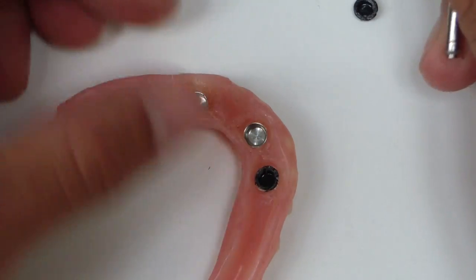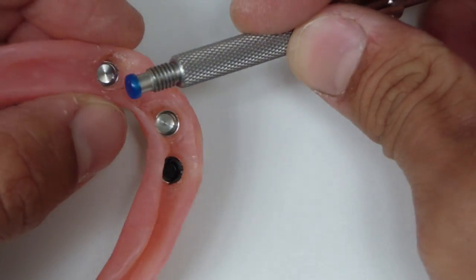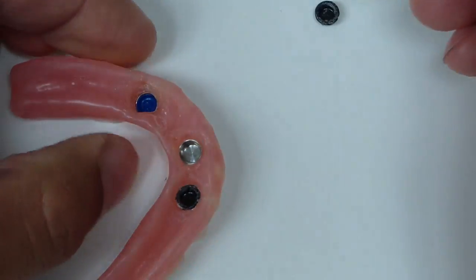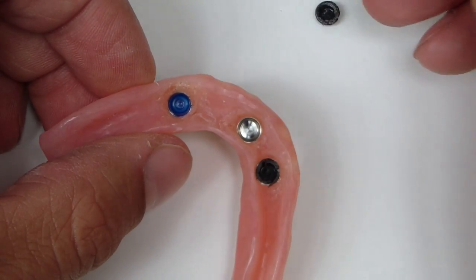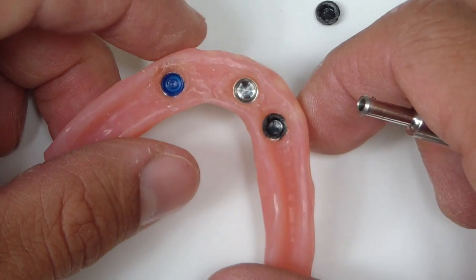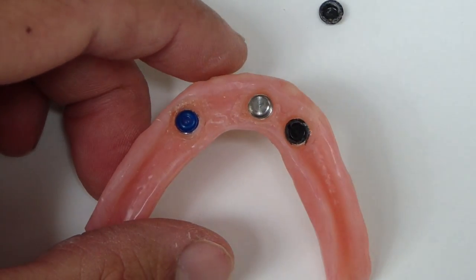We're going to start with the blue nylon insert — you can see it here — and we'll just place that into the denture now. Just like that. We typically start patients off with the blue, which is the light retention at 1.5 pounds. They increase up to 5 pounds. So I hope that helps. Cheers.